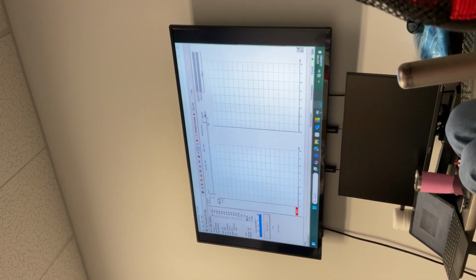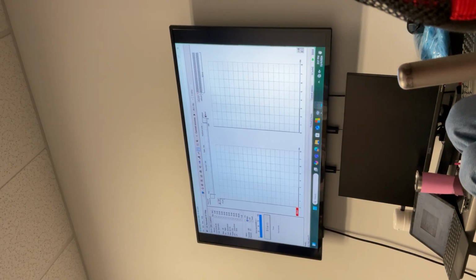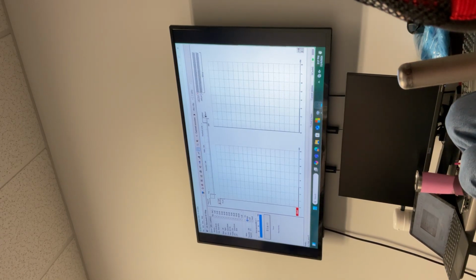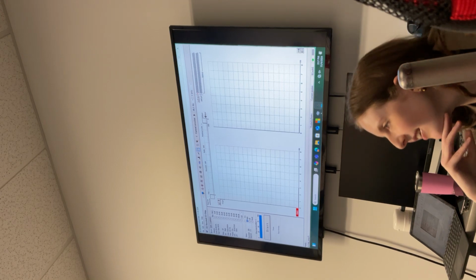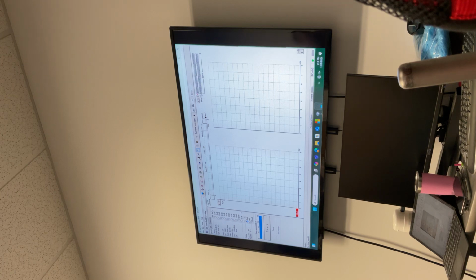Let me try this electrode on you. Where are you going to put the other one? Are there a lot in that bag? Yeah, the remaining electrode stock is in the bottom cabinet. There are 5 more of these. Feels better. Grippier. Stickier. Yeah, let's turn it on. It should all come from the top.